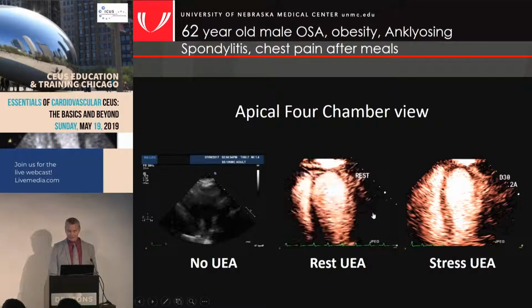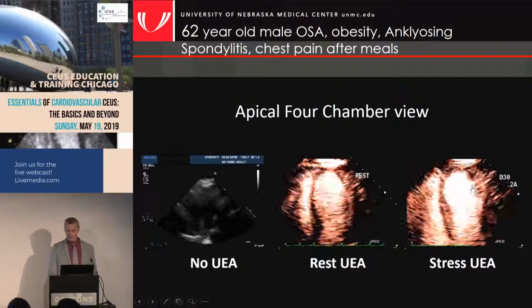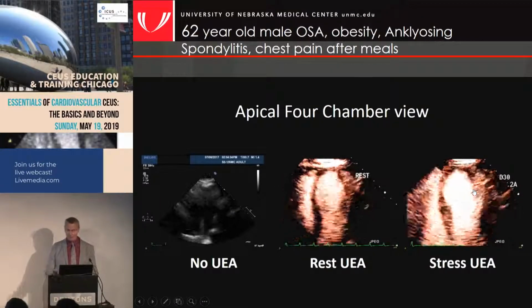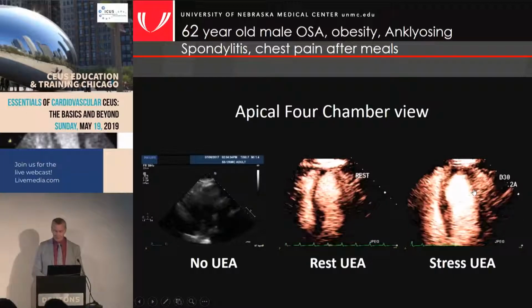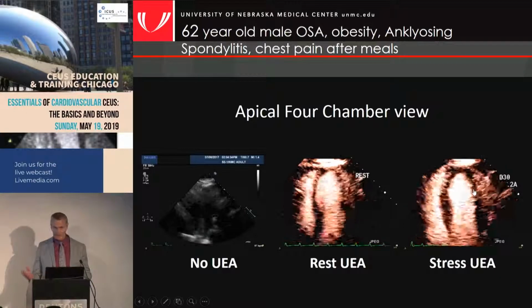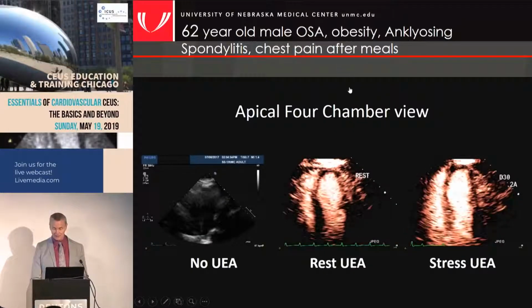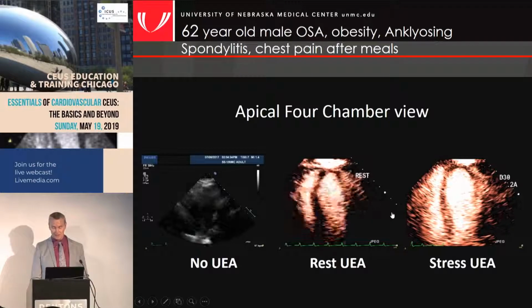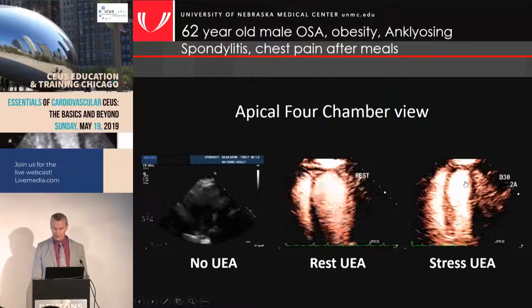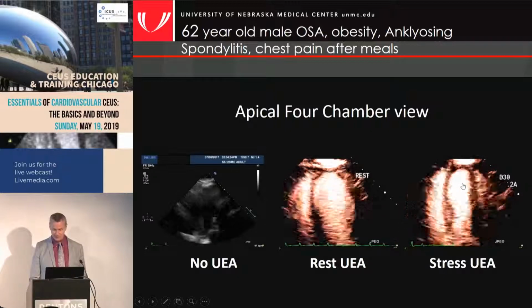Now the question is, is that viable even yet? Well, this is during dobutamine. You can see it probably becomes a little bit worse. But now we've gone from a totally uninterpretable study that would have required another nuclear study to be set up another day, and followed up how many days later. And a guy that probably was having significant angina. This was occurring after meals primarily. He was very inactive otherwise. He has extensive resting wall motion abnormalities, even more extensive and certainly more prominent during dobutamine. And this was done the same day, right after we got these bad windows.